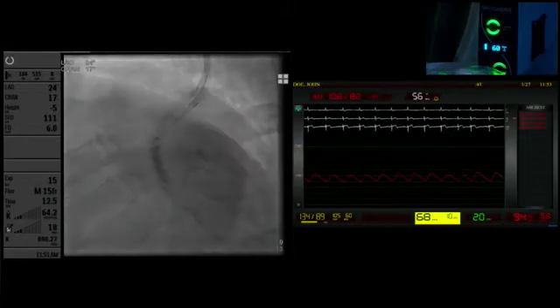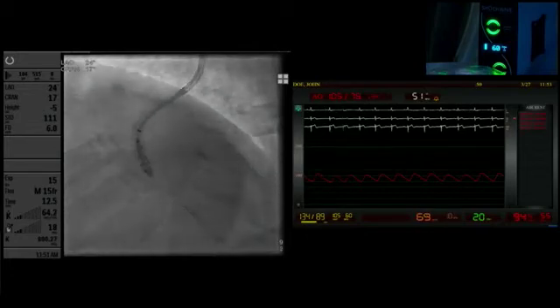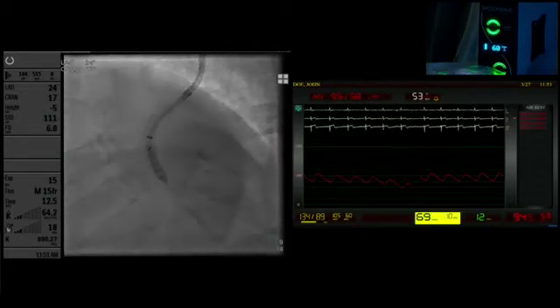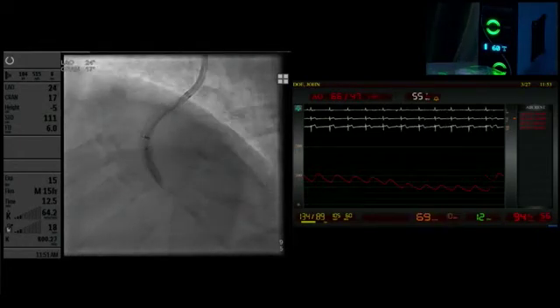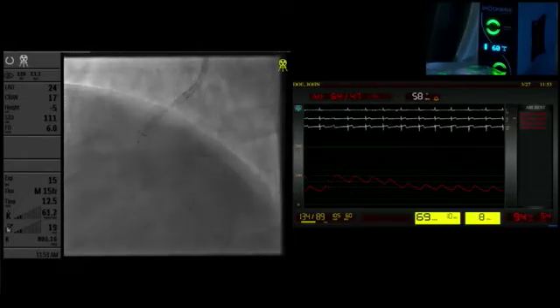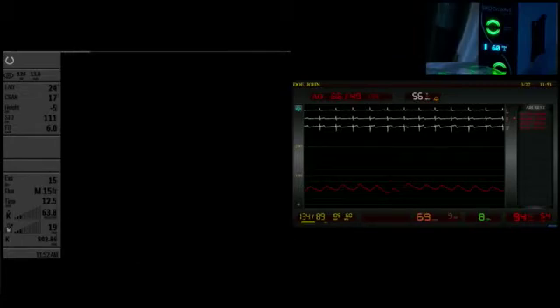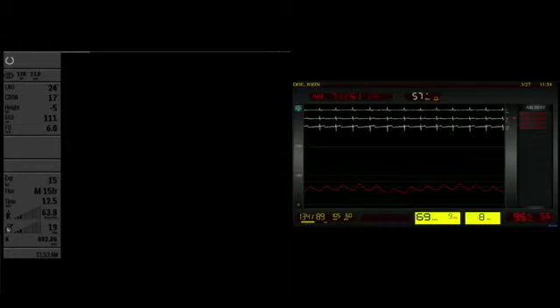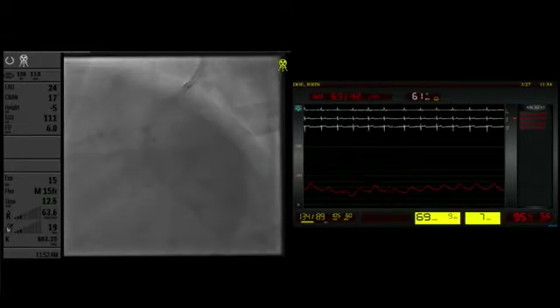Now, one thing you can do is make some small adjustments to the balloon position, either slightly further forward or slightly further back, so that you concentrate the energy next to each emitter. I personally believe it's more distal before you get a problem. So you're voting I move distal a little? Yes, I would, but I don't want to get it stuck. On OCT, it was only 5 millimeters from the edge of the stent. Yeah, it looks like it is a little bit distal. I believe it was a short segment, Maurice. Well, you could go a bit distal and then come a bit proximal.